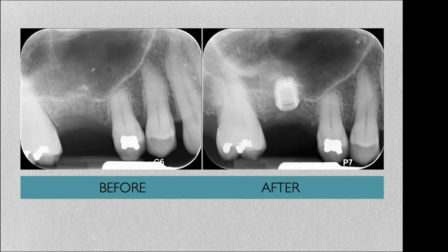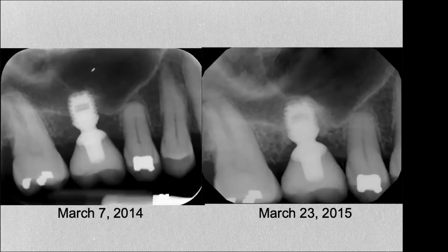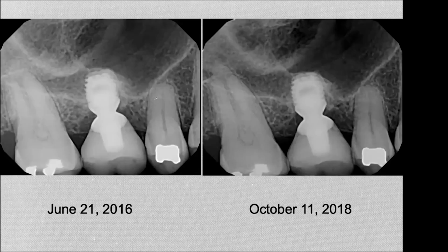We would have had to wait, probably months, maybe a year or so, to have it nicely defined. And so in this case, it helped us. Once we restored it and put it into function, you see how the bone, just like Wolff's Law implies, as you use it, it consolidates, it responds to those stresses. And over a period of 4 years or so, you see the bone is stable and consolidating and consolidating.